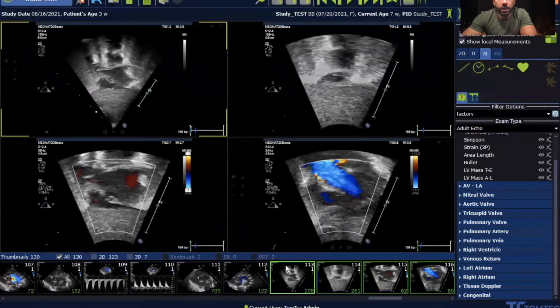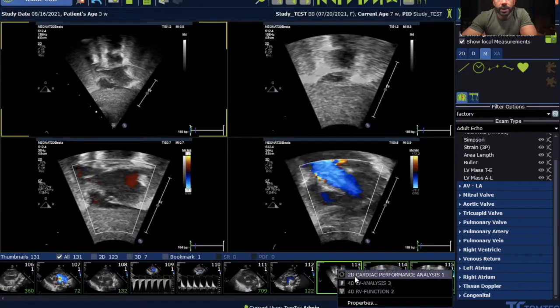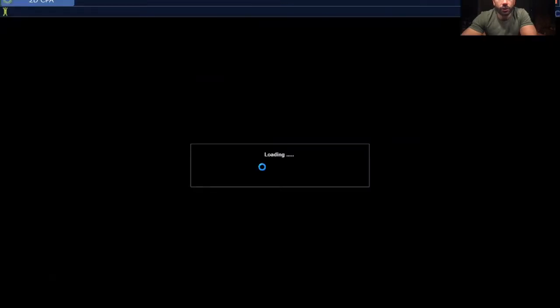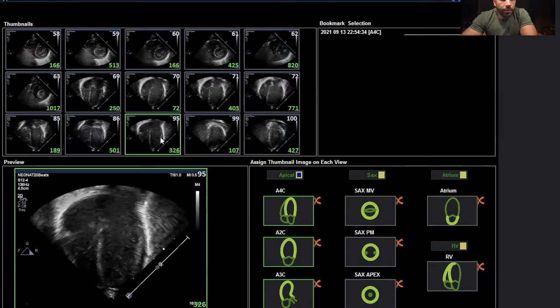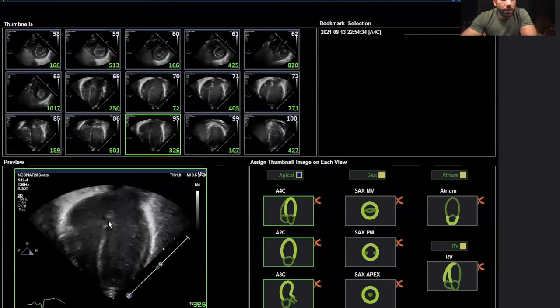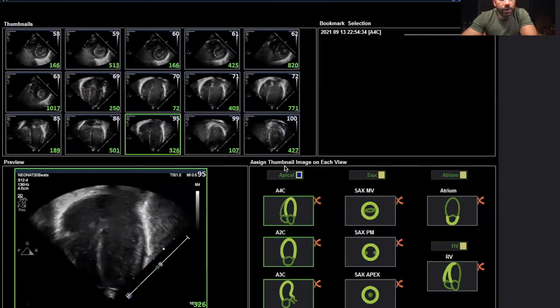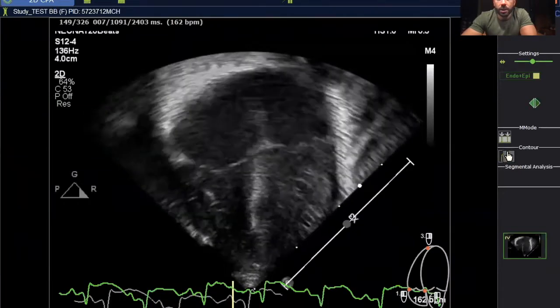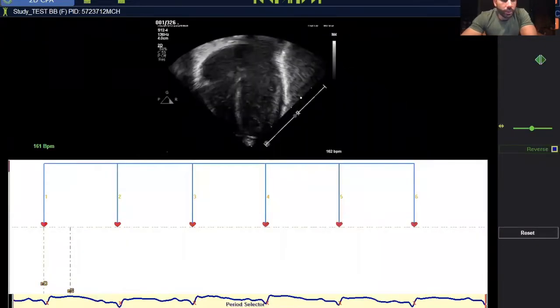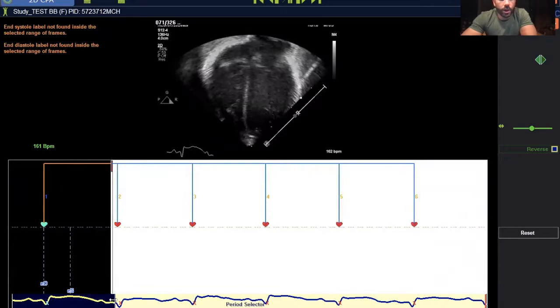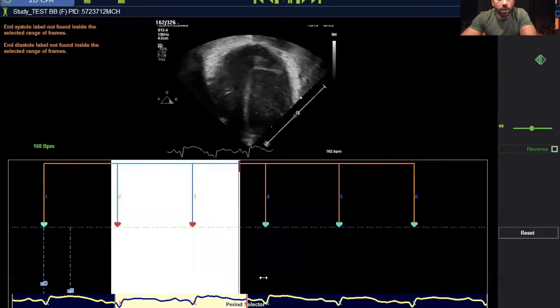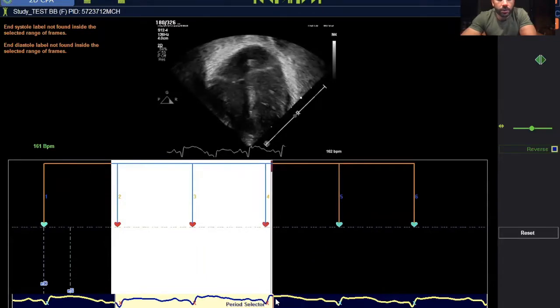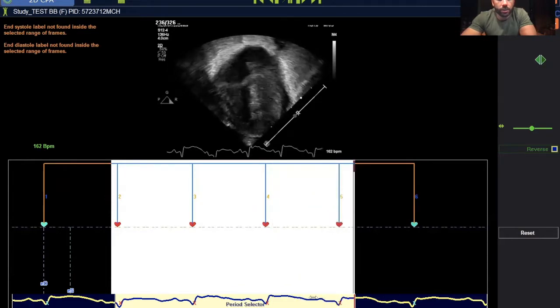We go back to the main TomTEC Arena and now evaluate RV longitudinal strain. For the right ventricle, you ideally want an RV-focused view or at least an apical four-chamber view showing all layers of the RV. I can see the RV clearly here, so I select this clip for the RV section. Again, note the image flip between adult and pediatric conventions. We have a few cardiac cycles and select the one where we have the entire RV free wall and septal wall visible.